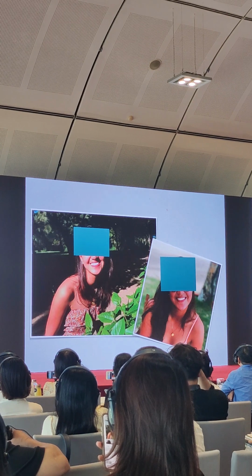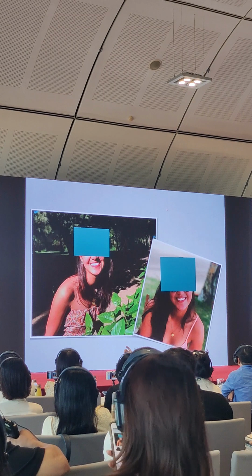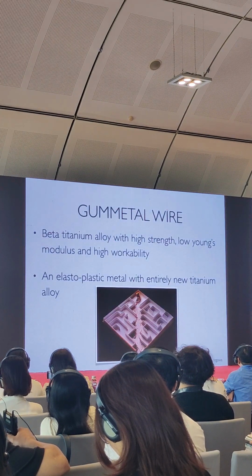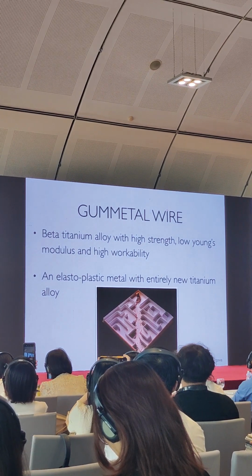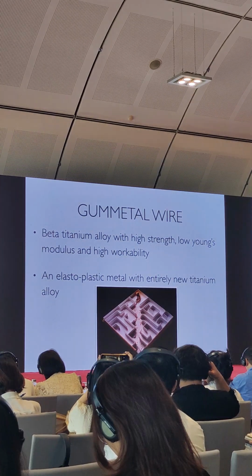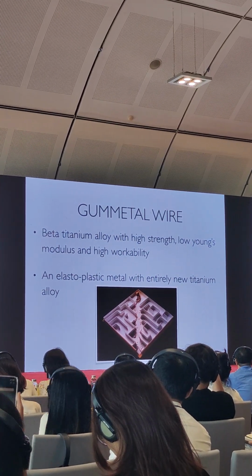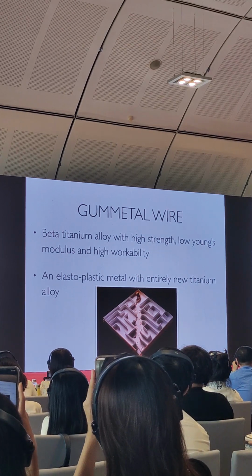One last case is for class 3 open bite. We know about gum metal wire. Everybody knows about the properties of the gum metal, that they can use it also for correcting, and it is almost like an alternative to the MEAW wire, because in the MEAW wire we have a lot of loops, but with this one we place only a little bit of a loop.